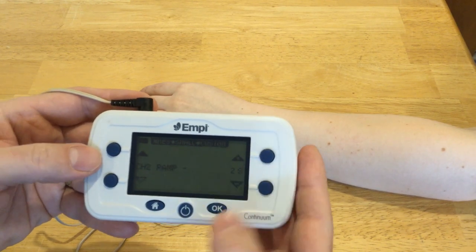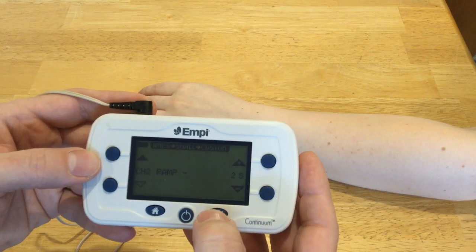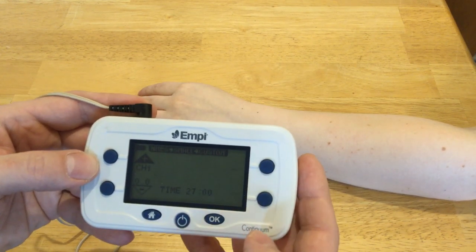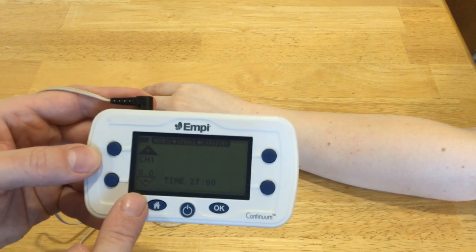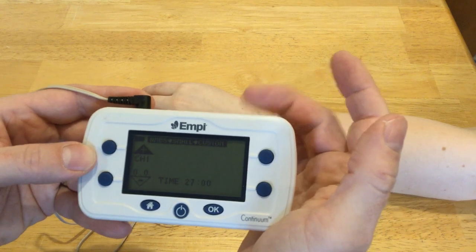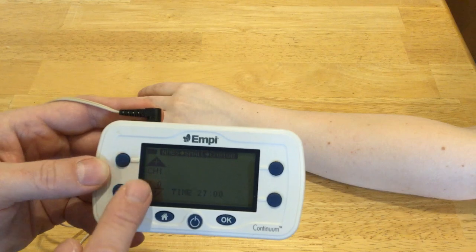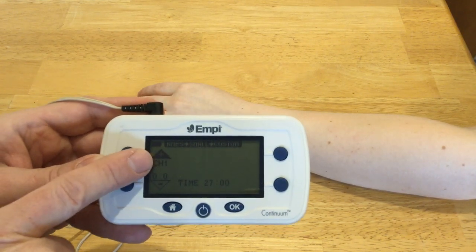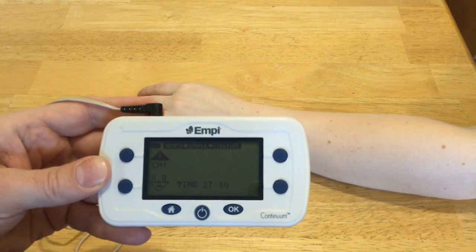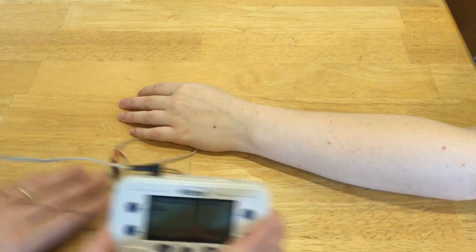Once I've gone through all of that, I just push okay. Channel one is ready to go; it doesn't show channel two because there's nothing plugged in, and the time is set at 27 minutes. When I start using this button to increase my intensity, the timer will start. To decrease the intensity, I'd push the bottom button.